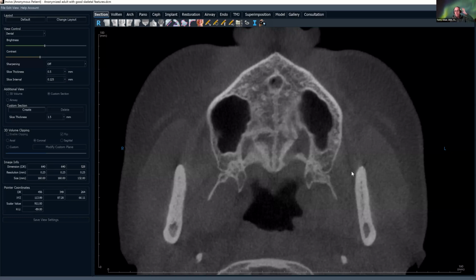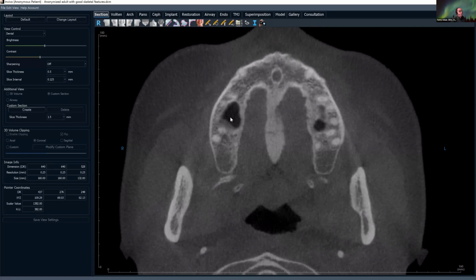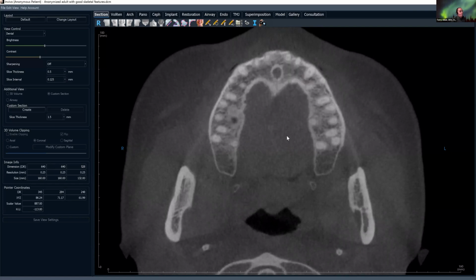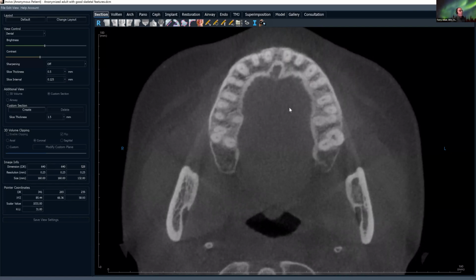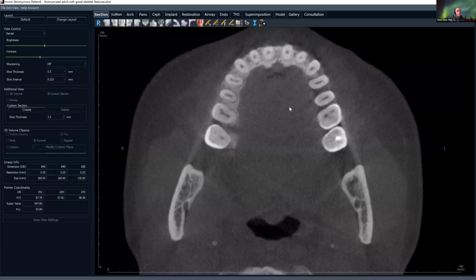But what we don't want to miss is something wrong, pathosis with the teeth. Pardon me, everybody. It's bound to happen. So I'm going to scroll through, and I want to start at the superior point of the apices. This is a point where you might begin to see periapical pathosis. I'm scrolling through inferiorly, and about right here, I want to pause because this is commonly where you'll see invasive cervical resorption. It's not all that uncommon.